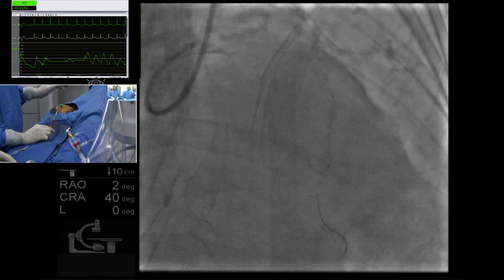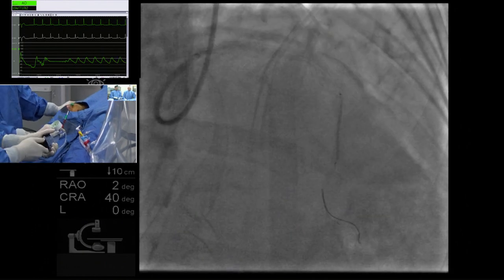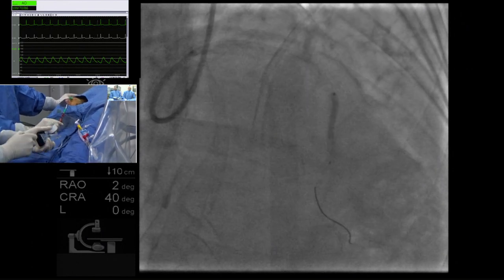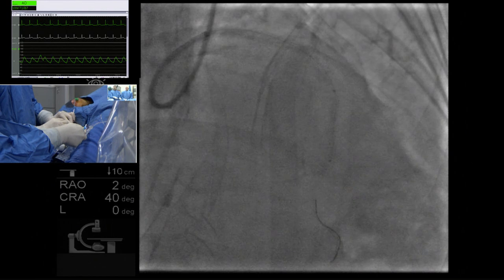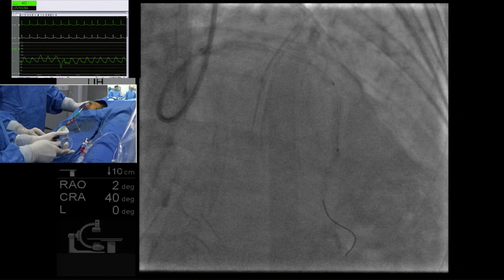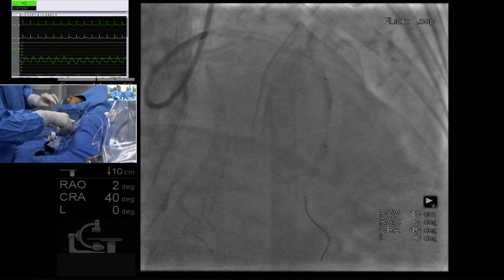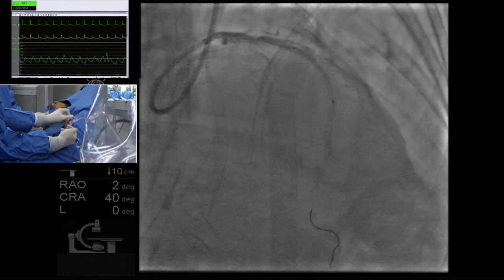Okay, fine. Go. Here, go on 10. 10 is okay. Maybe 12 maximum. This looks good. Deflate. High pressure, like this balloon, Sanjay, high pressure will not work much. But anyways, go. 20. It will expand too much. See? It looks like 2.5. It will dilate too much.